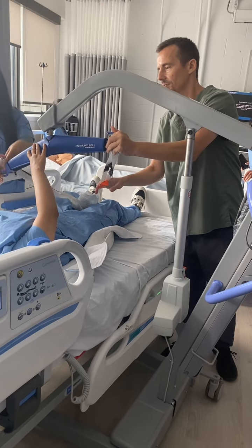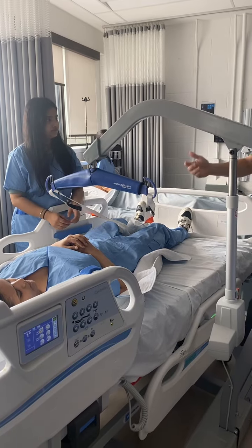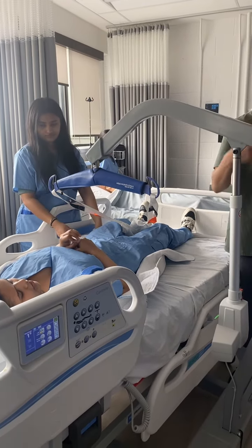You hook them up. Upper extremities are good. Maybe the patient can help. If the patient can help, I let them hook it up.